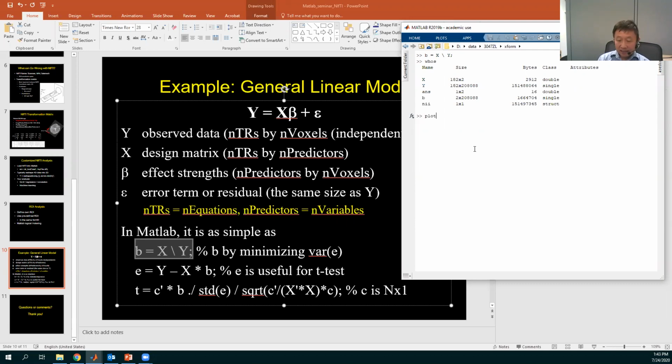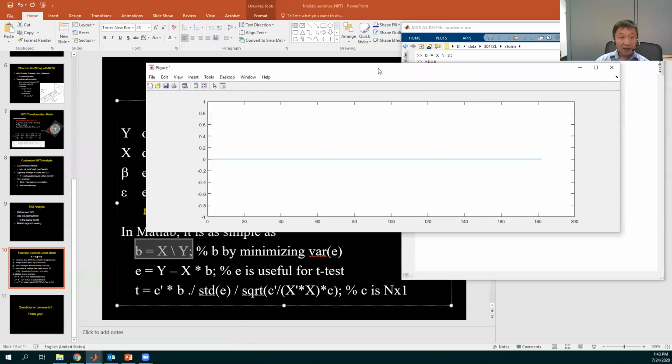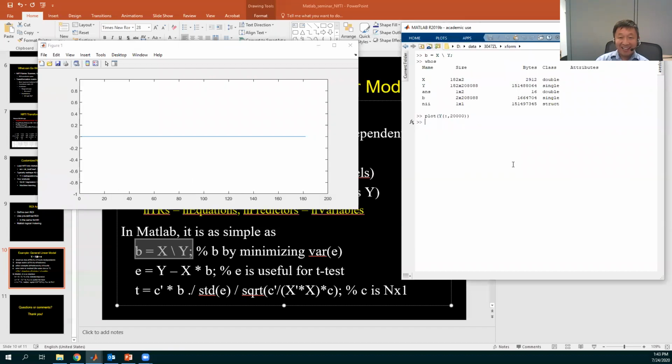if we plot some Y, let me plot a random voxel. Huh. Unfortunately, I get one outside the brain. So I don't know which one is inside the brain. I'm so unlucky. Because 2/3 of them are 0, this is outside the brain. I can't believe it. Let's plot all of them. That's too slow. Probably it's going to crash.